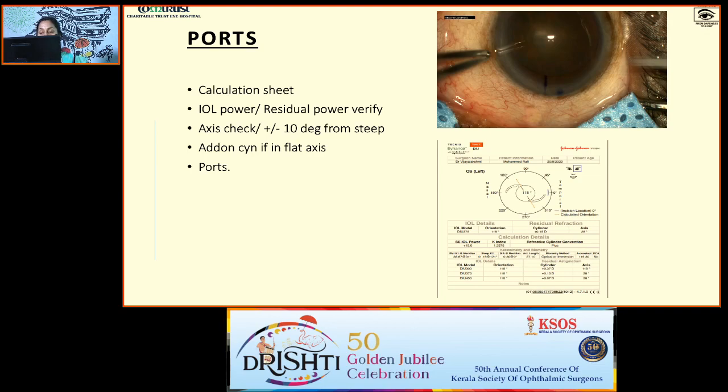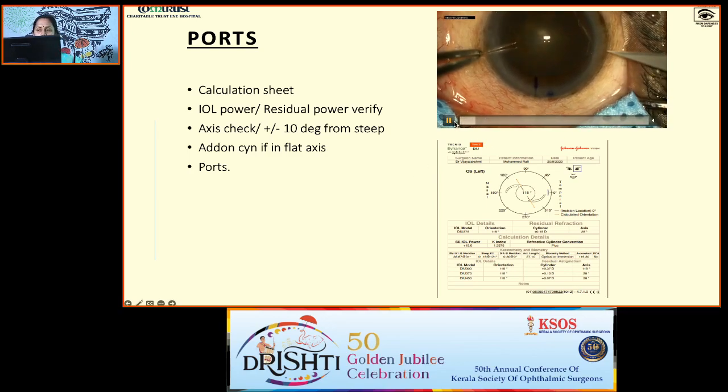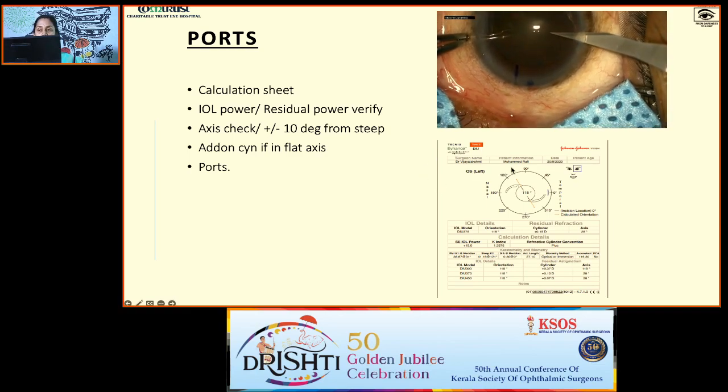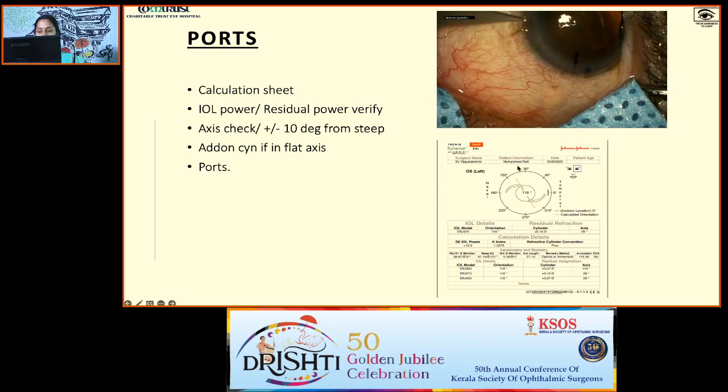And always see the alignment axis is plus or minus 10 degree from the steep axis. If you are putting somewhere near the flat axis, you will be adding on the cylinder. In the calculation sheet, always verify the patient's name and the eye and the remaining IOL power, that is the toric power remaining. Here in this video, you can just make the ports just like any other case of phaco. Just only one thing to be careful, avoid the alignment axis.